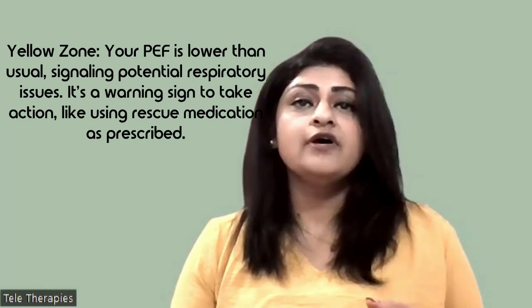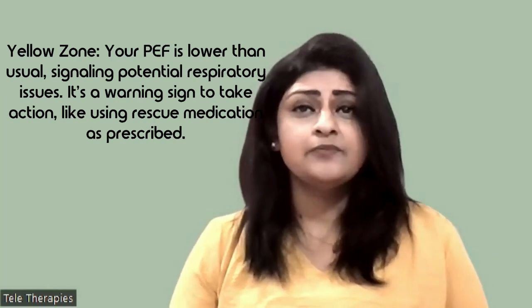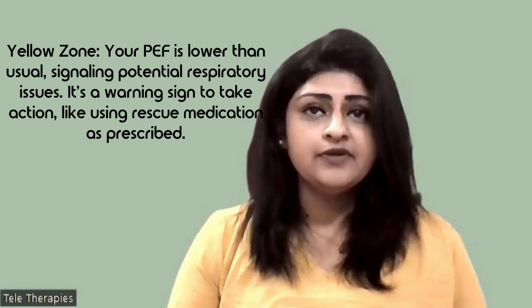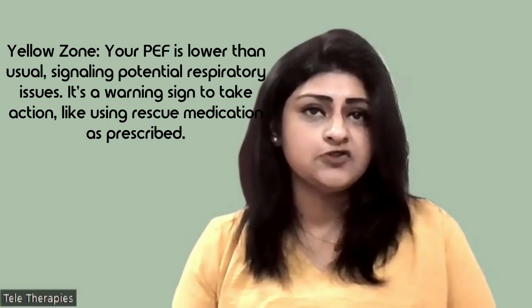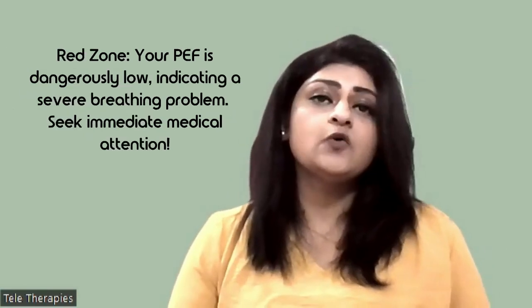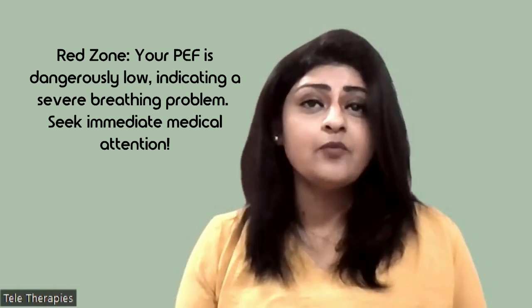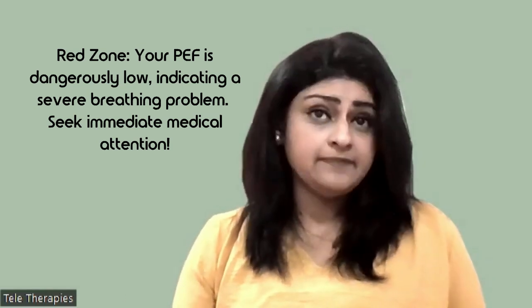Yellow zone: your peak expiratory flow is lower than usual, signaling a potential respiratory issue. It's a warning sign to take action, like using a rescue medication as prescribed. Red zone: your peak expiratory flow is dangerously low, indicating a severe breathing problem. Seek immediate medical attention.